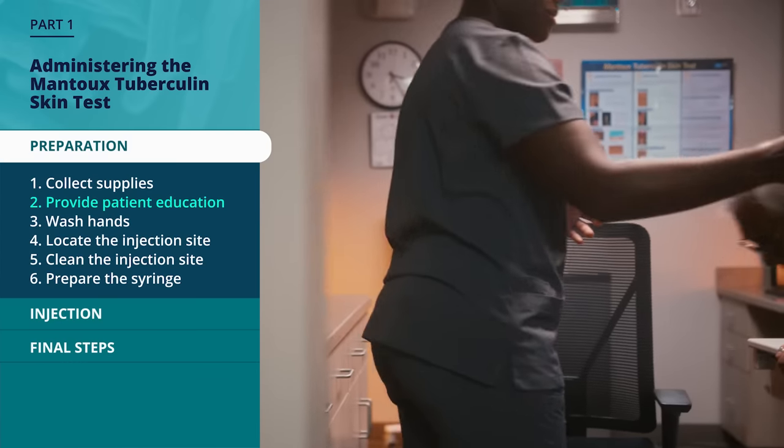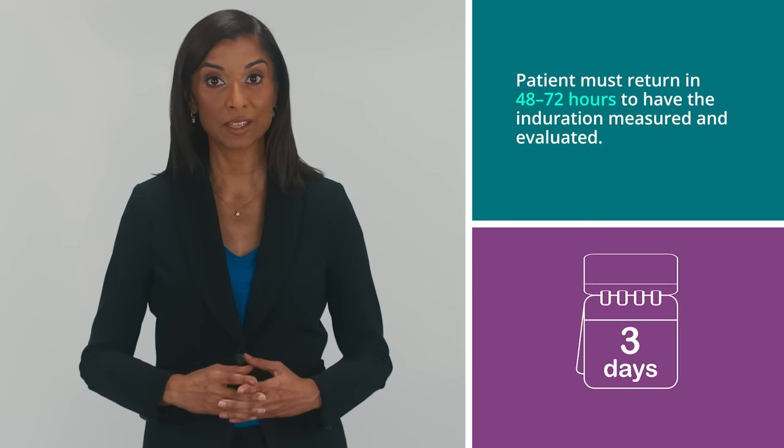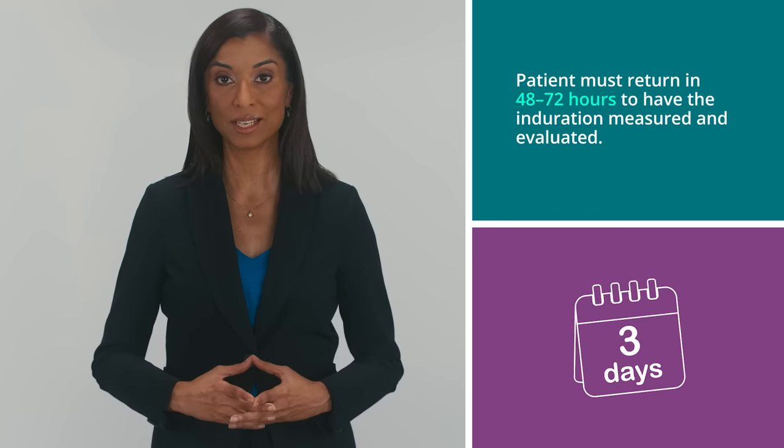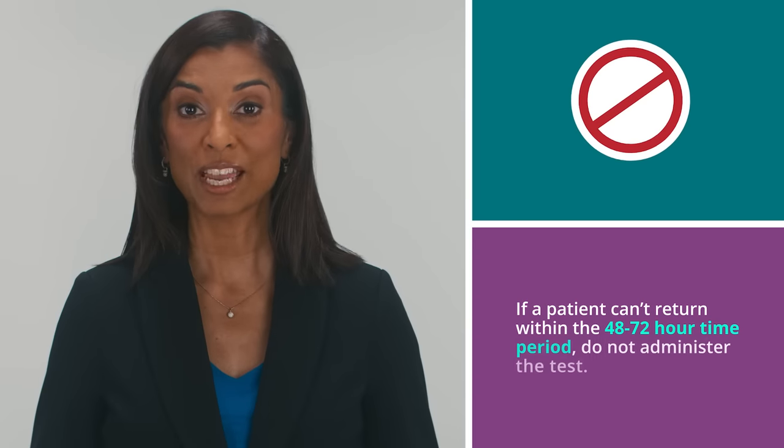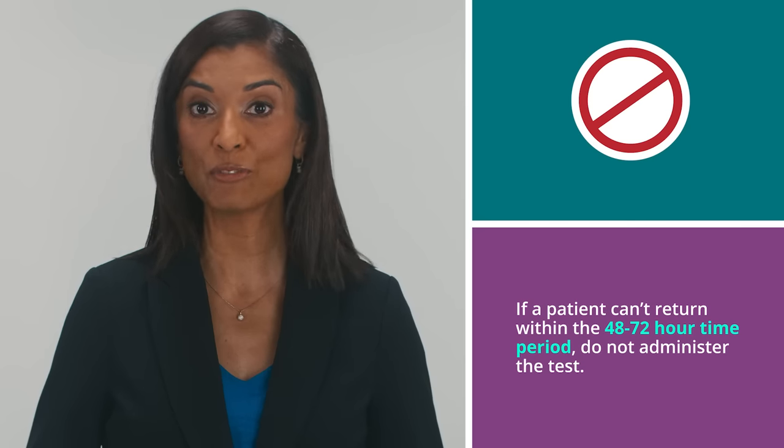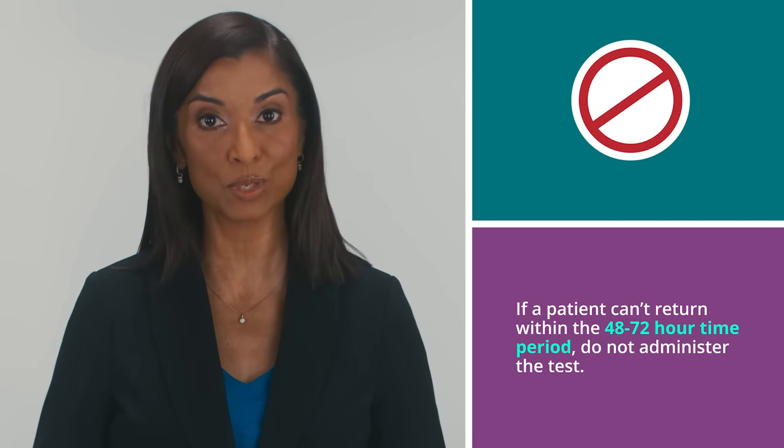After collecting supplies, the next step is patient education. You should sit so that you are both comfortable and facing each other. Discuss why the skin test is being given, what is involved in the procedure, and when the patient should return for the test to be read. Explain that 48 to 72 hours after the test is administered, the patient must return to have the induration measured and evaluated. Make an appointment for the patient to return. If a patient can't return within the 48 to 72 hour time period, do not administer the test. It's important to encourage the patient to ask questions they may have about the test.